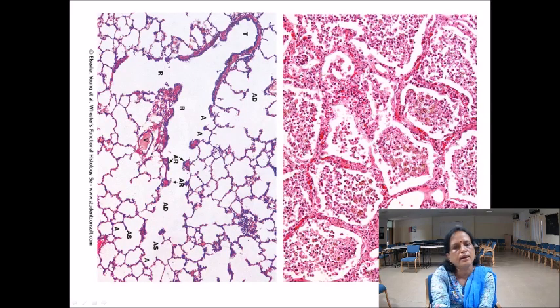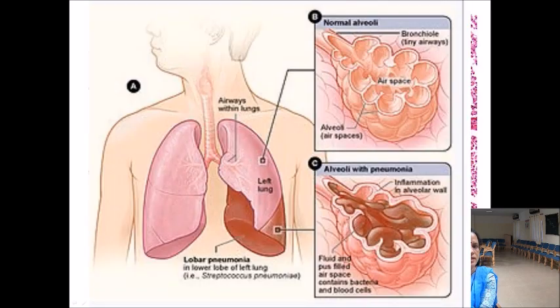Yes. So this is the lung histology, all of you have seen. This is the histopathology. Lung, these are alveoli. This is the alveolar septum. See, it is thin, it is not broad. Okay. So here the alveoli contain clear spaces, we say, that is air. Whereas here the alveoli, instead of air, contain something else. So invaders. What is it? This is the exudate. All these are neutrophils with fibrinous strands. So this is how pneumonia appears microscopically.